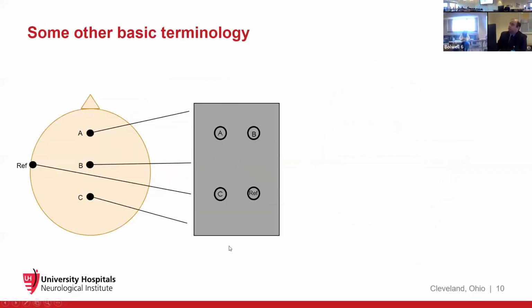All right. So now, just to show you, this is a hypothetical placement of electrodes. This is not how electrodes are actually placed, but I'm just showing you this hypothetical scheme to go over some basic terminology, which if you read a lot of EEGs or sleep-related neurophysiology, you have to familiarize yourself with. For example, let's say you have 3 electrodes here, A, B, C. This is roughly where you're going to place FZ, CZ, and PZ, the midline electrodes.